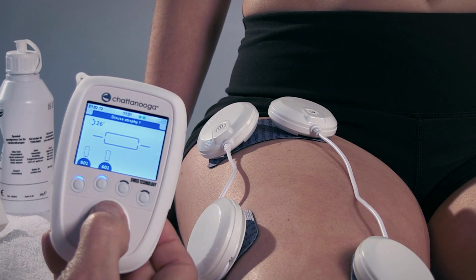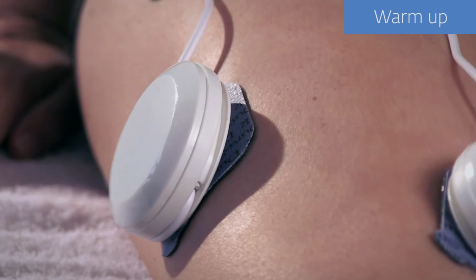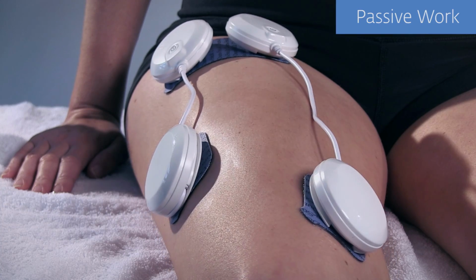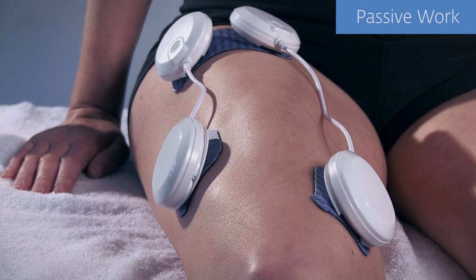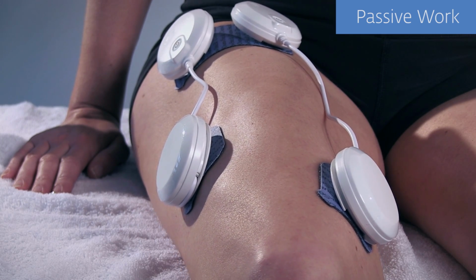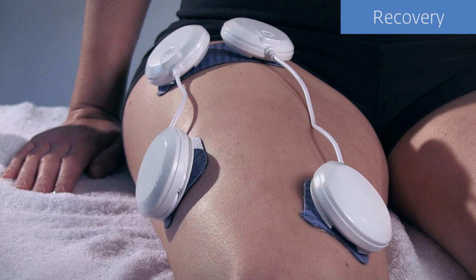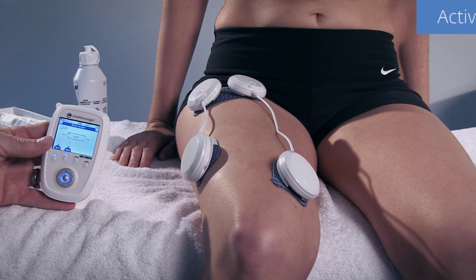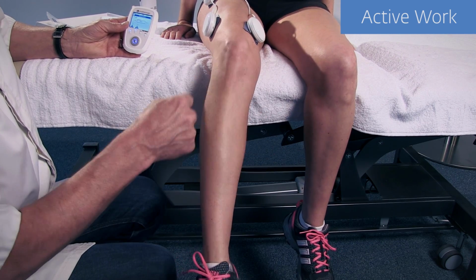For most programs involving muscle contractions, an optimal warm-up program is provided. After the warm-up, the Wireless Professional commences muscle contractions, followed by a recovery phase. Muscles can be worked passively or actively, depending on the stage of rehabilitation or outcomes required. It is generally recommended that treated limbs are not taken into full extension to ensure maximum comfort.